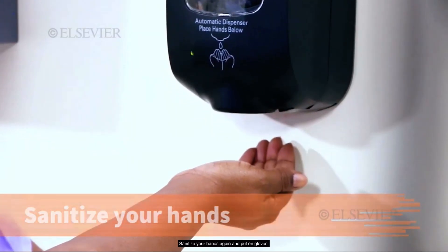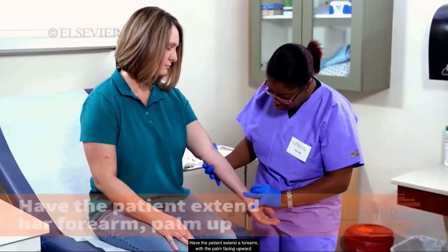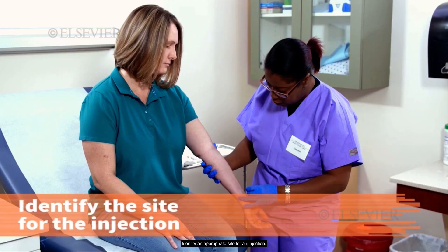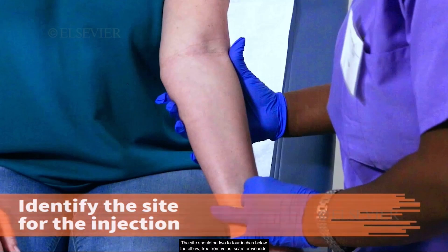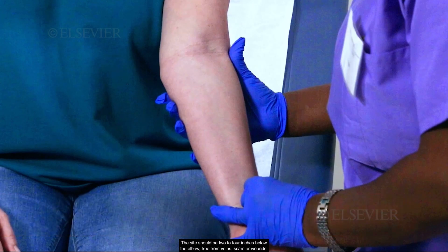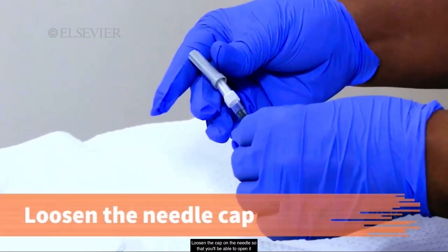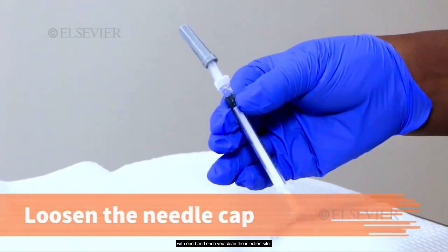Sanitize your hands again and put on gloves. Have the patient extend a forearm with the palm facing upward. Identify an appropriate site for the injection. The site should be two to four inches below the elbow, free from veins, scars, or wounds. Loosen the cap on the needle so that you'll be able to open it with one hand once you clean the injection site.